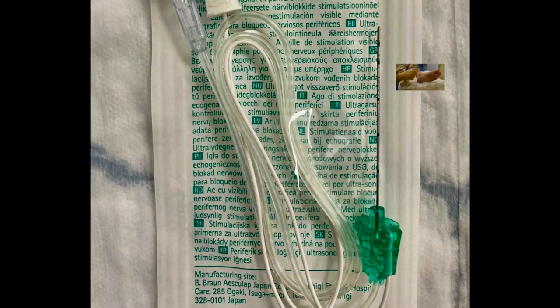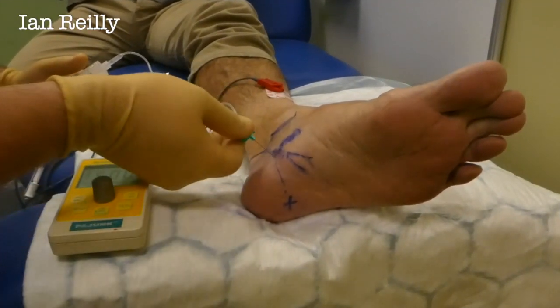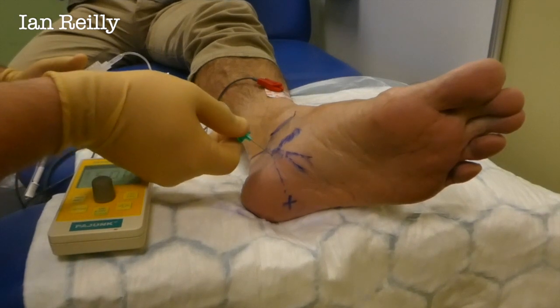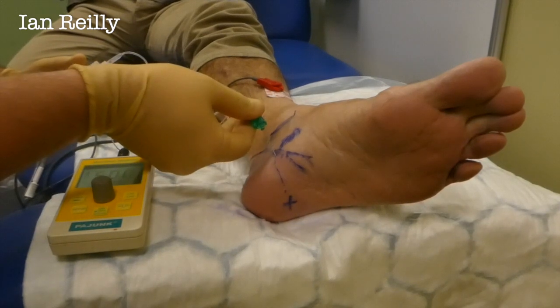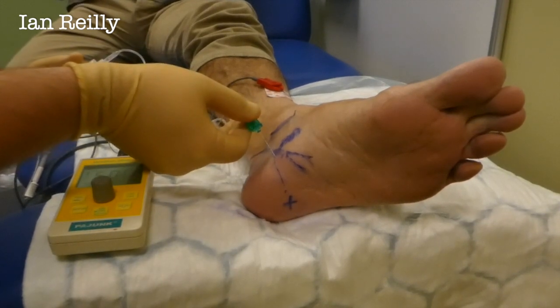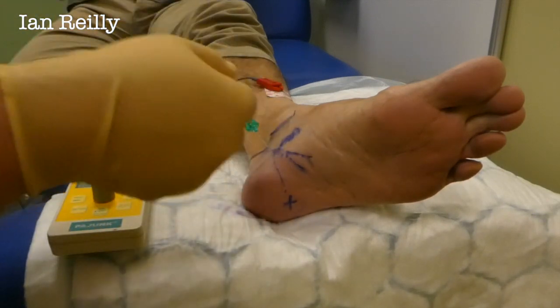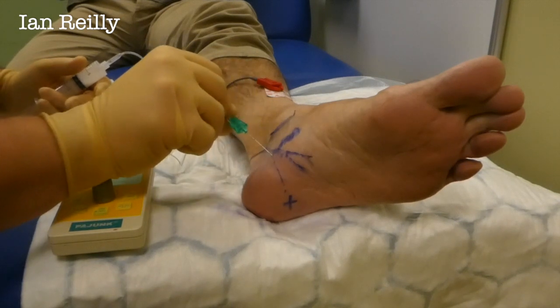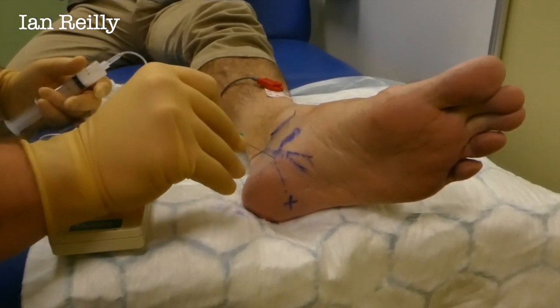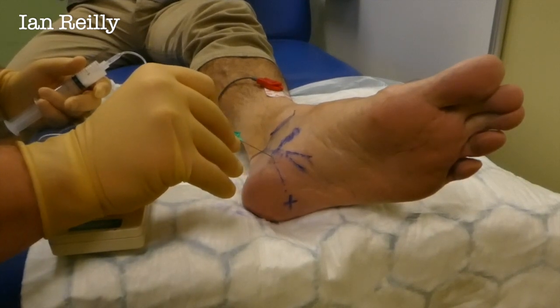Our nerve stim is set at five milliamps. The first thing George is going to do is locate some nerve tissue — we're looking for some twitching of the toes. One of the things, Peter, is we'll get the toes twitching, which is good, but I want to feel if you're actually getting some symptoms coming over that part of the heel. If you get that, let me know, because we often rely on the toes moving, but for this particular nerve I want to catch this one specifically.